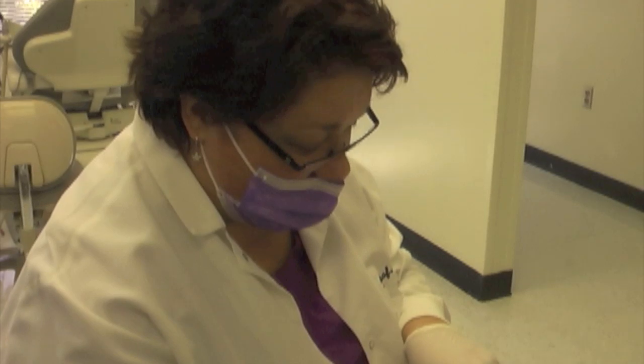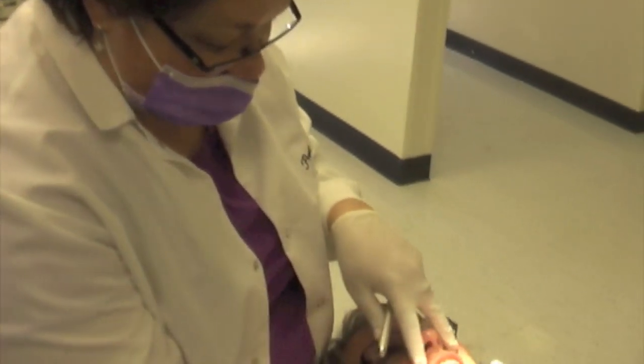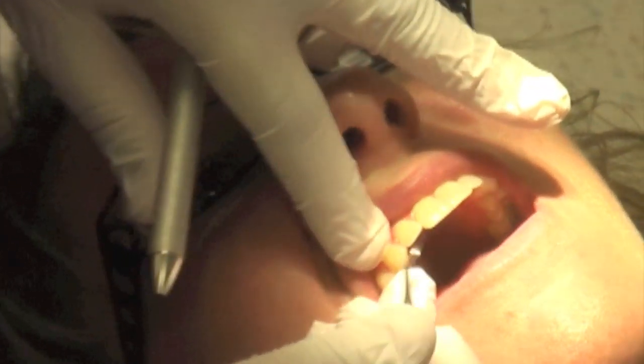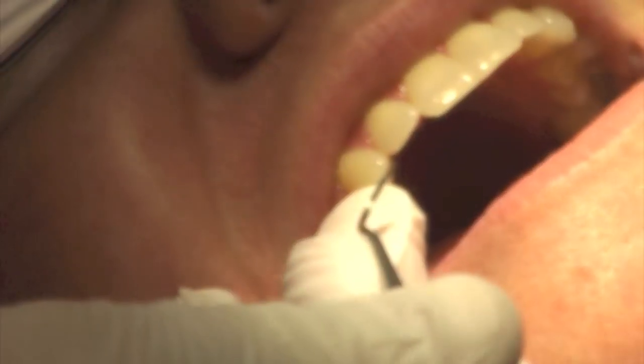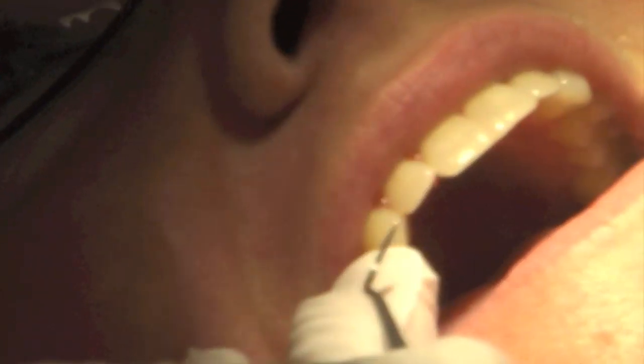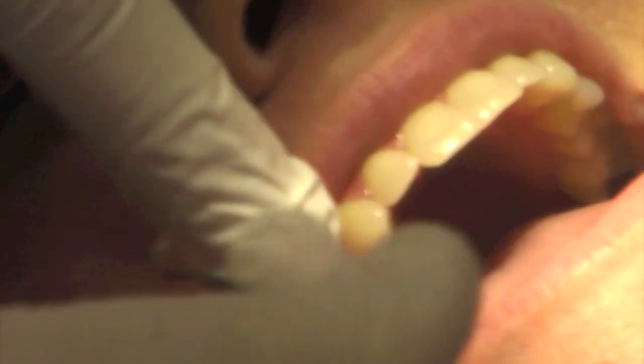Let me also show you up here on the maxillary anteriors. You're always going to do surfaces away from the 11 o'clock position, and surfaces toward from the 8 o'clock position. That's my spiel for the anterior teeth: go to 8 o'clock for surfaces toward, go to 11 for surfaces away.